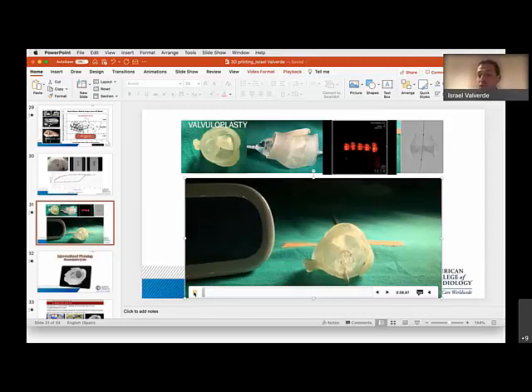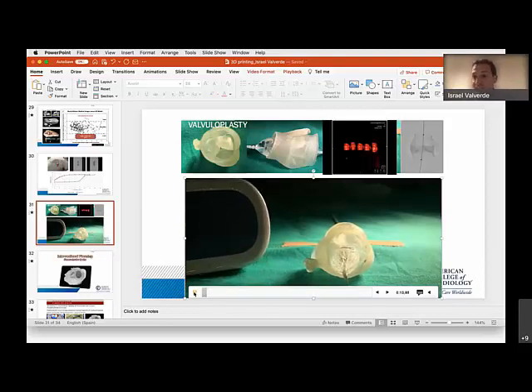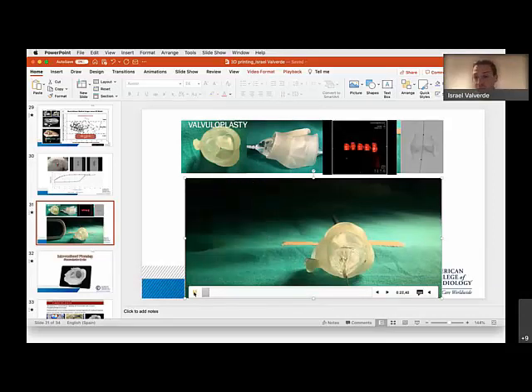And if you want to open an aortic valve, you need to use a different material. So you use Tango material, but not polyurethane. So I think we can fairly predict the same mimicking condition of the tissue. The only thing you have to play around with is the thickness of your material.